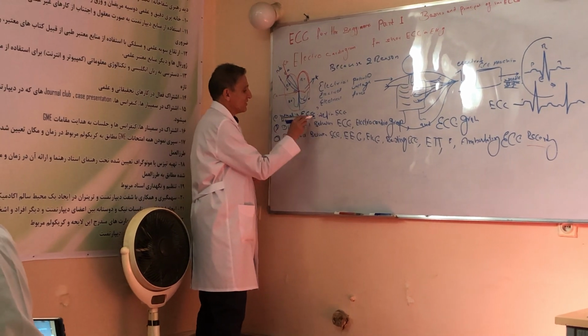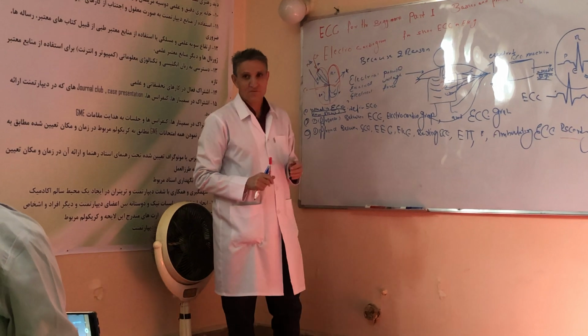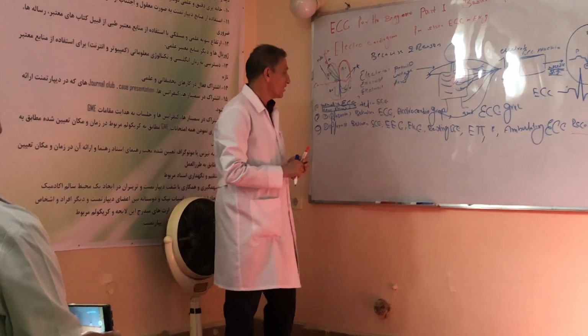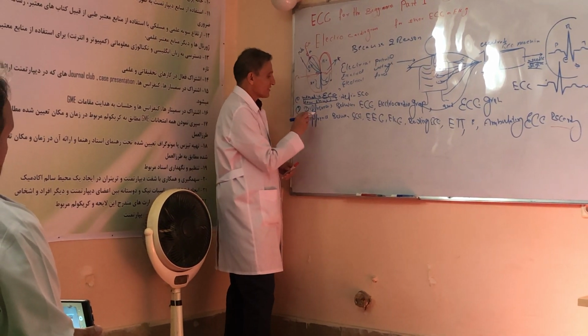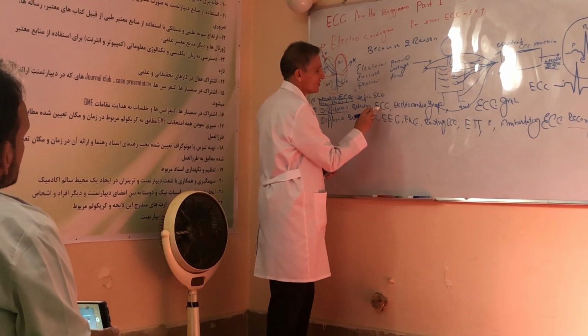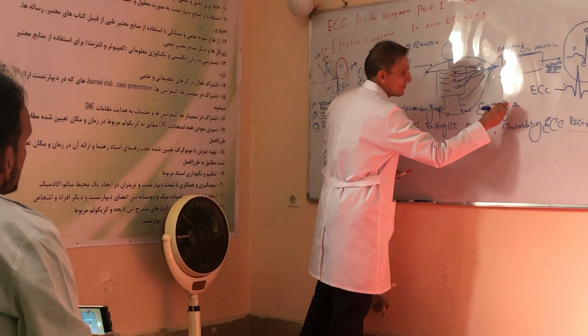Number 1, what is ECG? How should I define ECG? First of all, we should start from the definition, because everything should be started from definition. So I also start from definition. The second thing that we discuss in today's lecture: differences between ECG, electrocardiograph, and ECG graph.